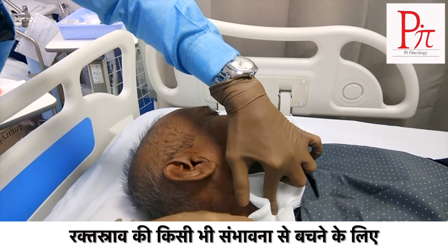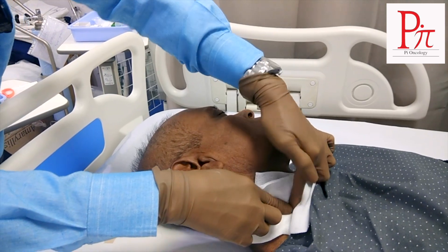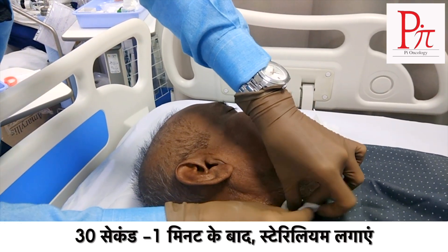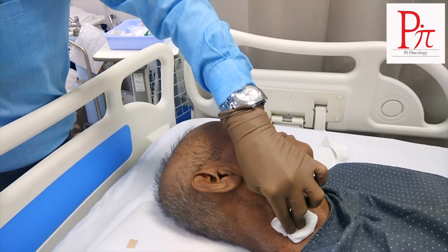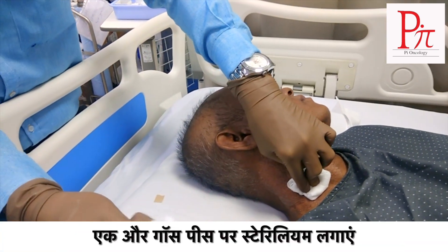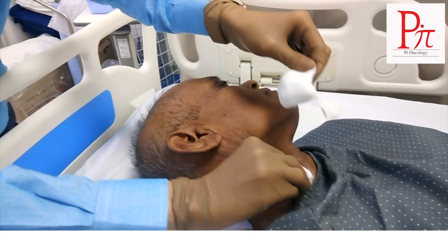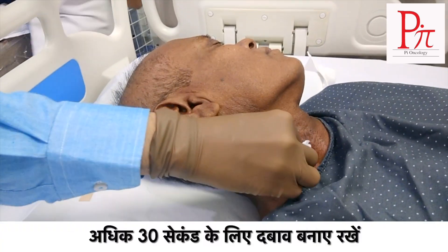After 30 seconds to 1 minute, we have to put a little bit of Sterilem at this place. Take another gauge piece, put a little Sterilem on this and clean the area. Maintain pressure for 30 more seconds.